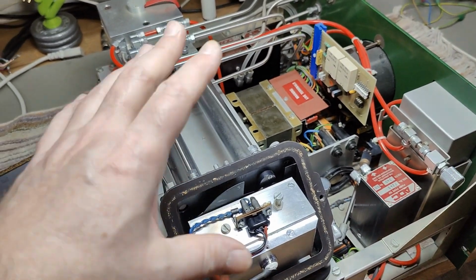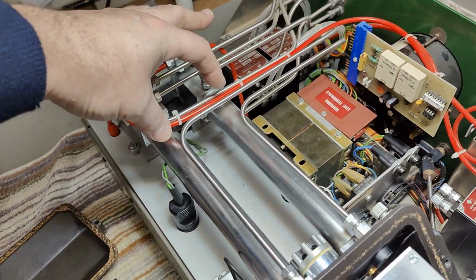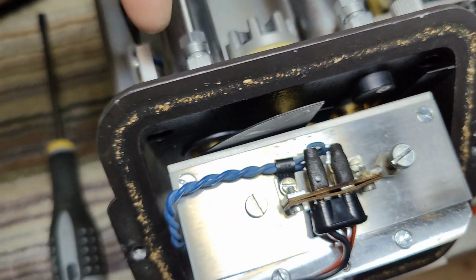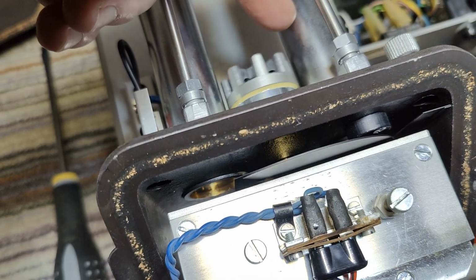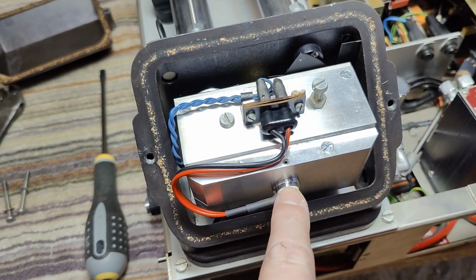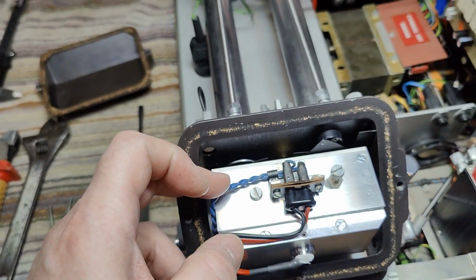So I believe there's a light source in one of the ends, probably in here, right? A light source or a detector of some sort, and some optics that goes via those two tubes. And look down here. So the two test samples or something like that, right? See, here is a light pulsing system, and in here is probably a light source or a detector. See, there's something going on here. Ooh, nasty. Now I got dirty fingers. But anyway, in here we will have to go and have a look what is in here.